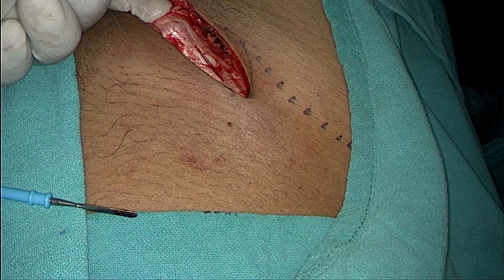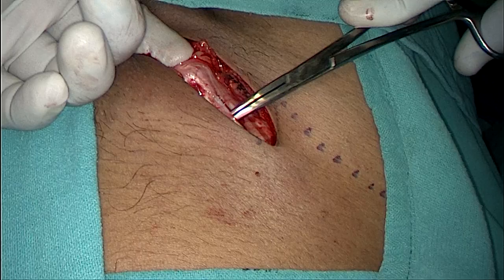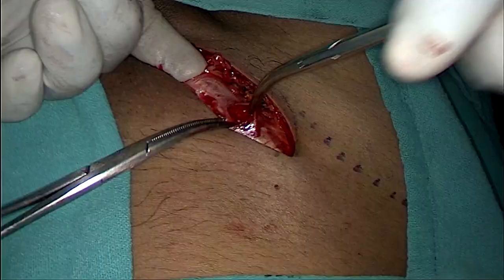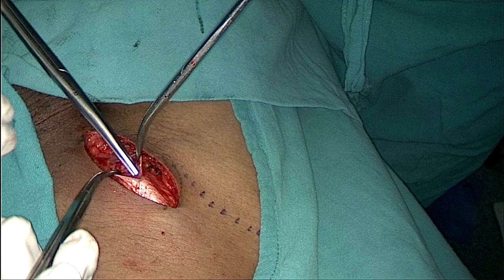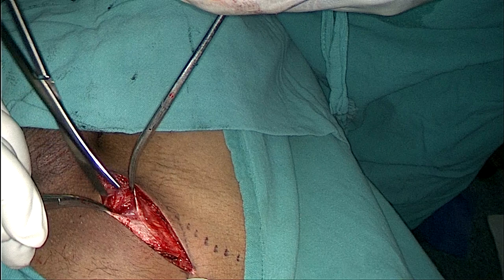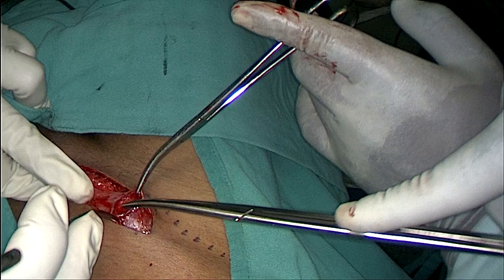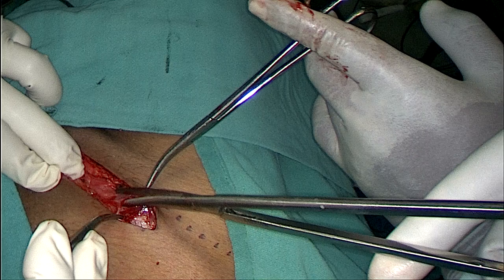Now I'm making the space for artery forceps, holding a flap of the external oblique aponeurosis and cutting down the fibers of the external oblique aponeurosis in the same direction. Try to maintain hemostasis as much as possible at these stages. Now I'm cutting down the fibers of the external oblique aponeurosis in the direction of the superficial ring. I am holding the superficial ring with my left index finger, which makes the step easy and avoids any unnecessary injuries.